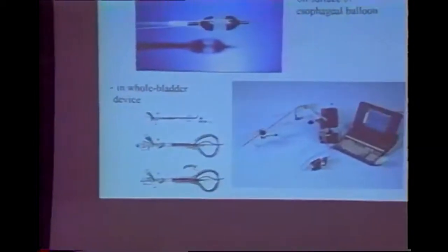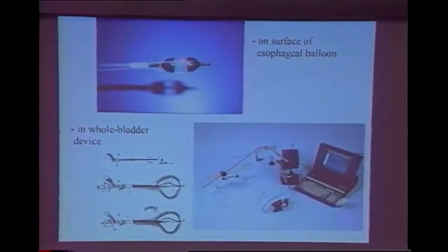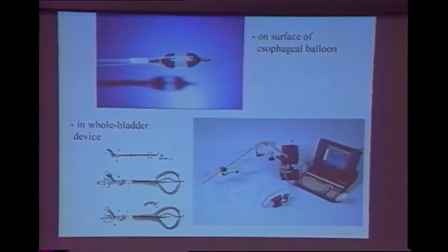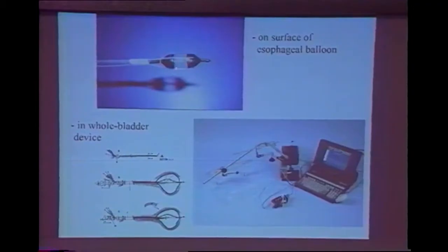These have been used, for example, in the esophagus. You can attach these probes to the balloon, so that it can go down into the esophagus, and you can measure the surface dose of light. You try to standardize that between patients.